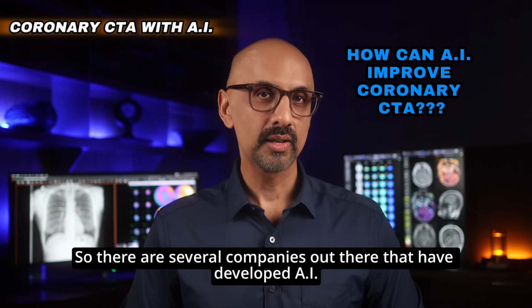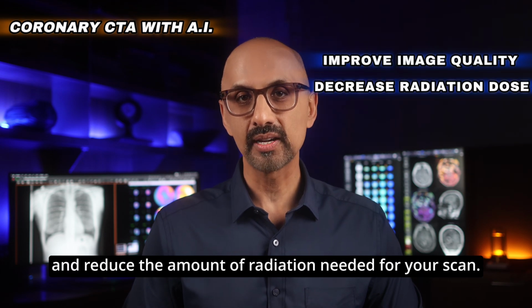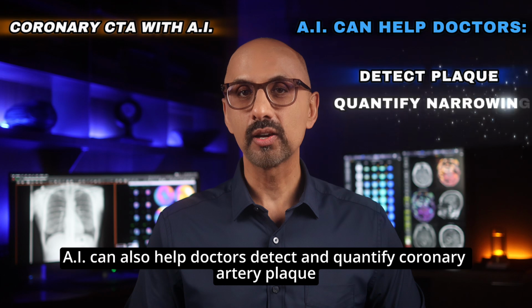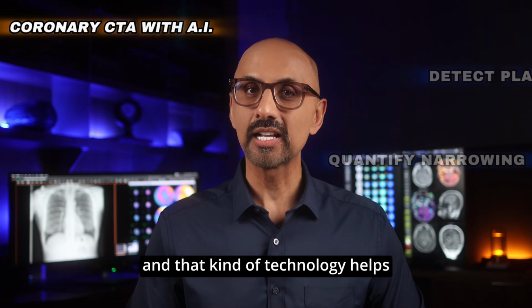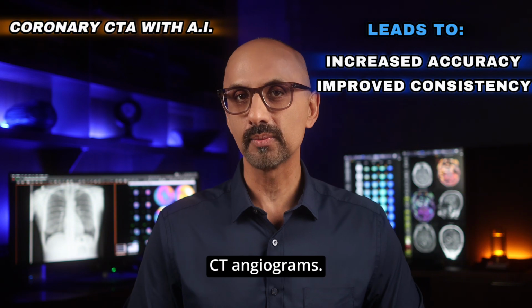So there are several companies out there that have developed AI software that can improve image quality and reduce the amount of radiation needed for your scan. AI can also help doctors detect and quantify coronary artery plaque, and that kind of technology helps them provide more accurate and consistent interpretations of coronary CT angiograms.